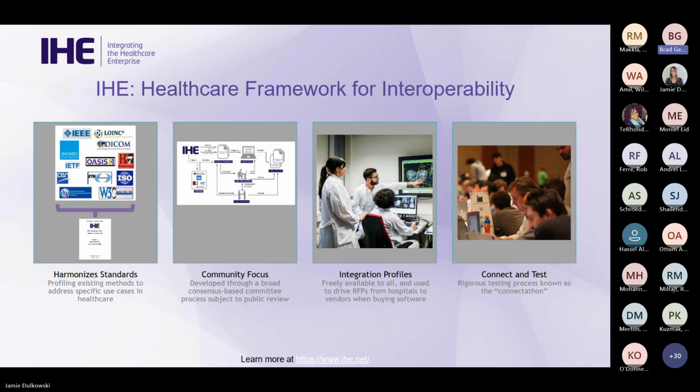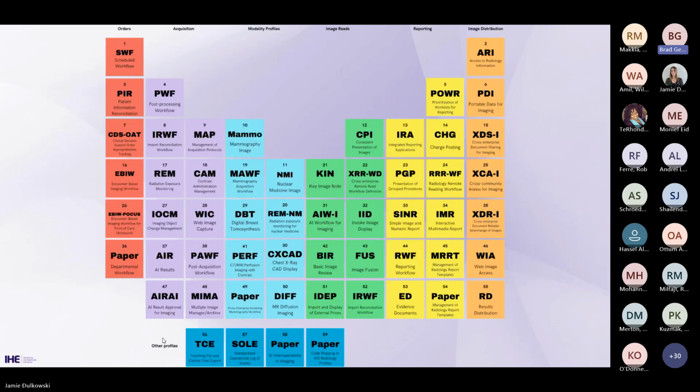Just to show some of the breadth of the profiles that are developed across the board in radiology. If you think about the workflow of ordering an exam, protocoling, acquiring images, reading the images, writing the report, and distributing that, there are profiles across the spectrum that IHE Radiology has developed.